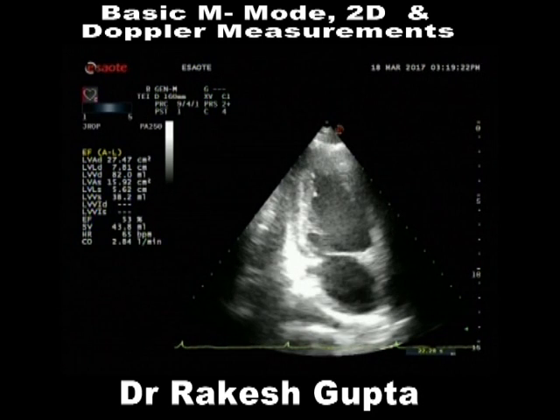Now the smallest one. Measure. Same I'll trace. So almost 50% ejection fraction.